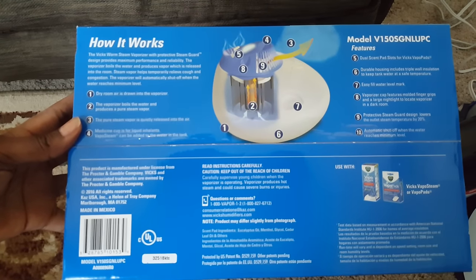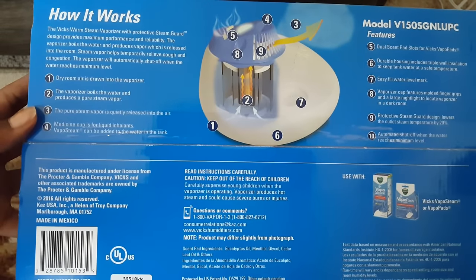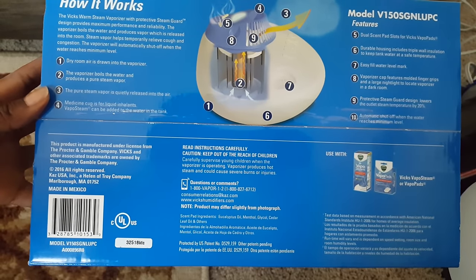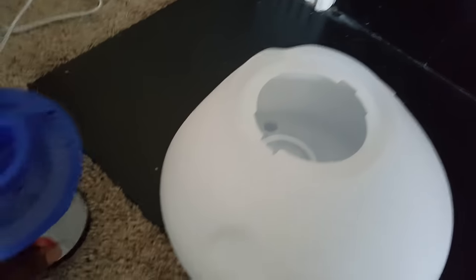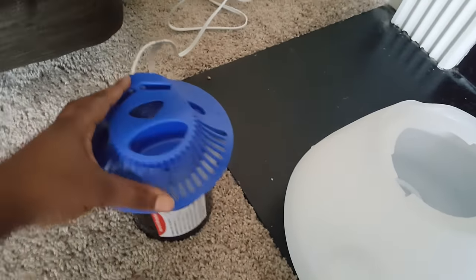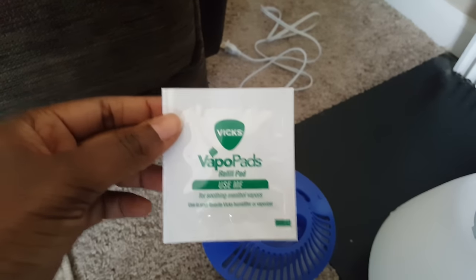This is how it works. Basically it comes with two different parts: this big container and this part right here. It also comes with these vapor pads — two of them.